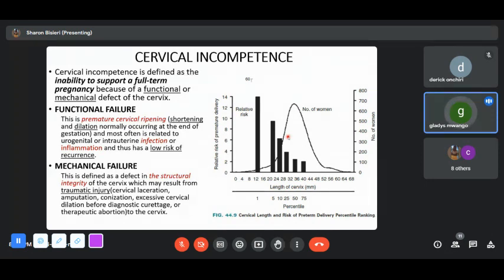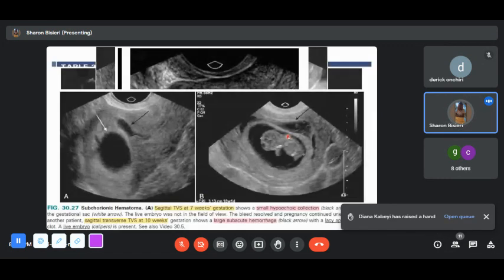If maybe there's a centimeter that is left, that would be a patient who, if the cervix is incompetent, may need to be on bed rest, and there may still be time to put in stitches and things like that. That is something the gynecologist would like to know. So the length of the remaining closed cervix should be documented. All right. So next we'll go to cervical incompetence.